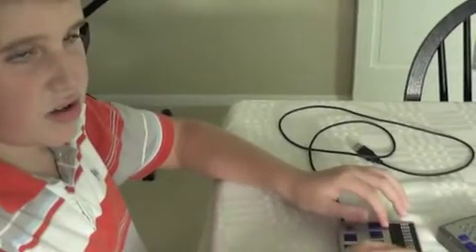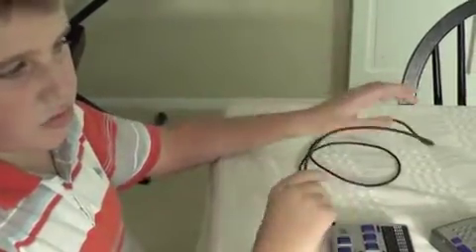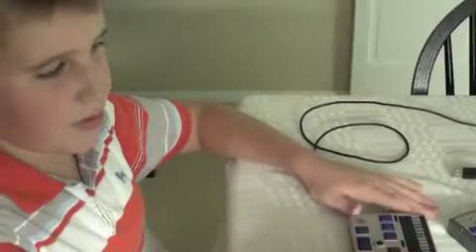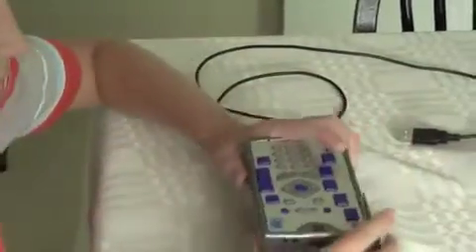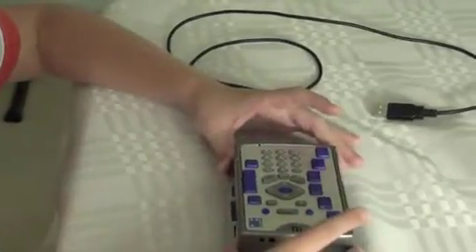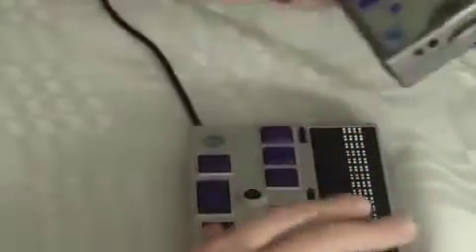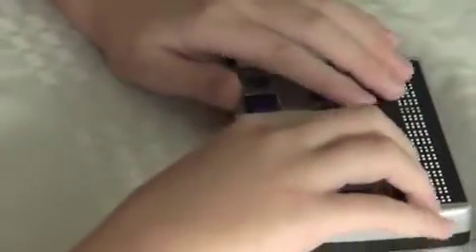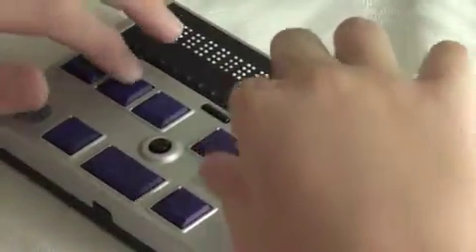It also has Bluetooth and USB — as you can see I have the USB cable plugged in right here. I'll describe the Refresher Braille 18: it is about the size of the Braille Plus. I'll hold the Braille Plus right by the Refresher Braille 18 so you can see how close in size they are — they're about the same weight. The Refresher Braille 18 has two layouts: the default layout, which is with the Braille cells furthest away from you, and the alternate layout, which is with the cells closest to you.